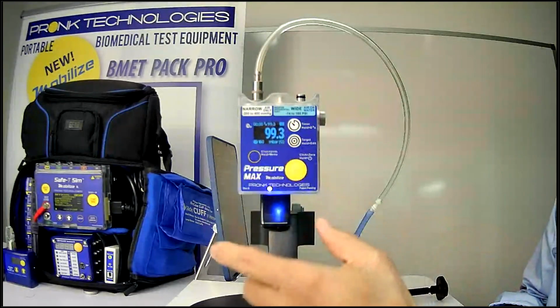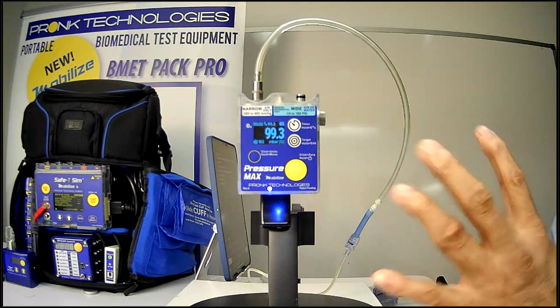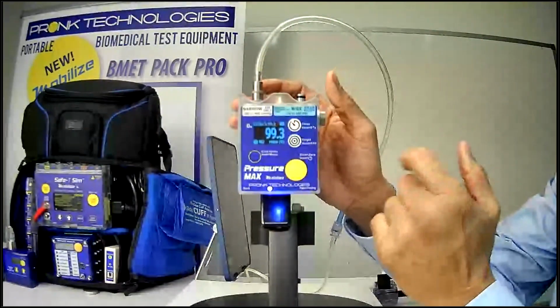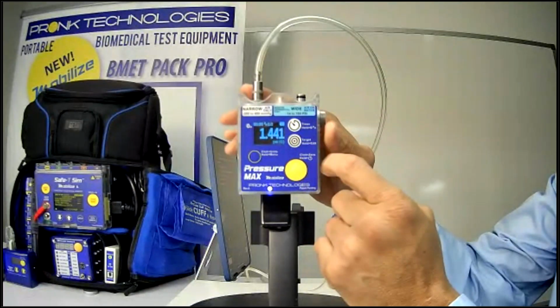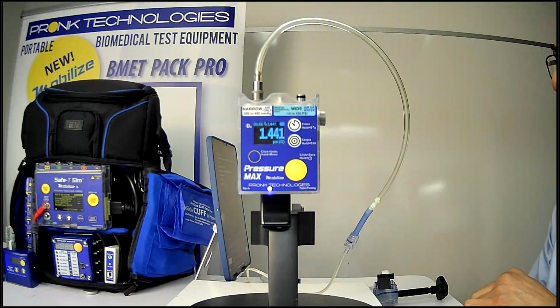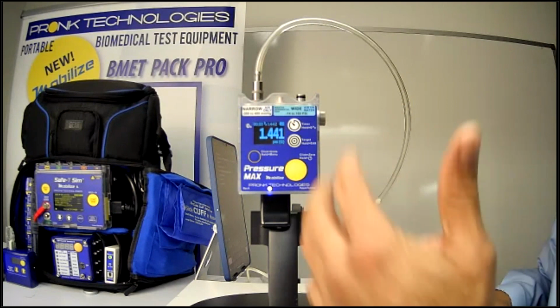So once you go back to the main screen and you have targets illuminated here, that's when the unit activates and confirms for you whether that pressure is within the target. If you don't want to utilize the target, then you could just scroll until the target symbol disappears, and now you could just utilize it to measure pressure and anything you want. So that's a basic way on how you would utilize the product.